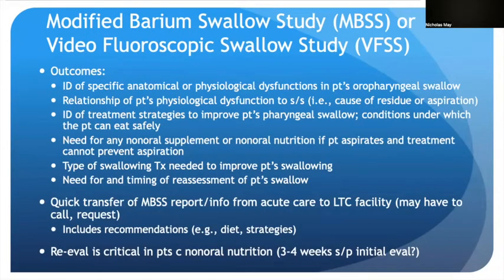Okay, and relative to modified barium swallow studies, also known as video fluoroscopic swallow studies, the outcomes are identification of specific anatomical or physiological dysfunctions in the patient's oropharyngeal swallowing mechanism, identification of the relationship between the patient's physiological dysfunction and their signs and symptoms. So that might be, what is the cause of residue or aspiration? Identification of treatment strategies to improve the patient's pharyngeal swallow and the conditions under which the patient can eat safely.